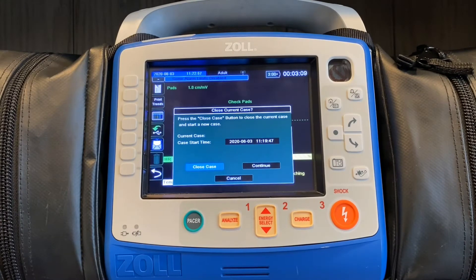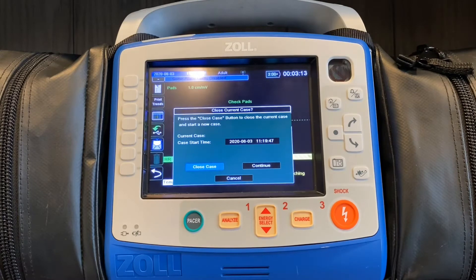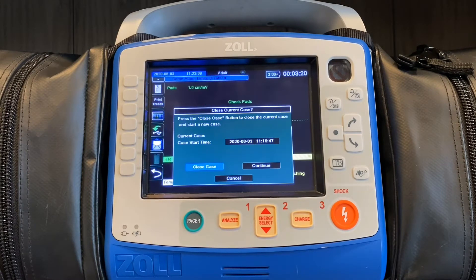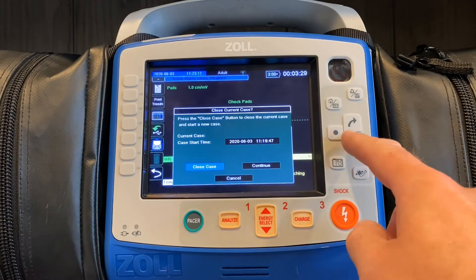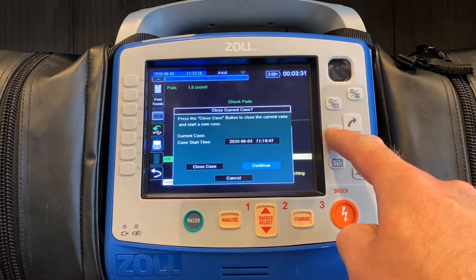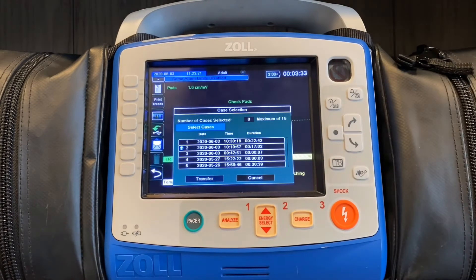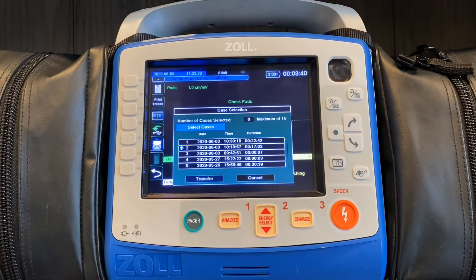The screen will come up and say, do you want to close case or continue? Depending on when you're doing this will dictate your choice. If it's at the end of the case and you're basically done treating the patient, you can go ahead and hit close case. If this is 10 minutes after the call, you can go in to continue, and you'll see a list of the calls that have previously been closed. They're all identified by date, time, and duration, so they're easy to figure out.